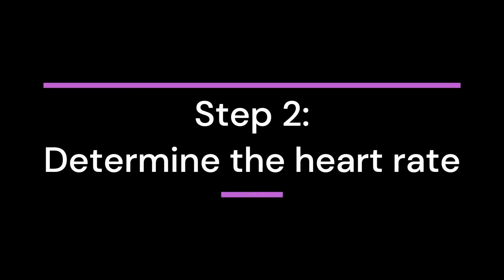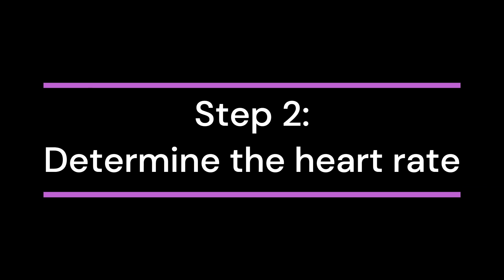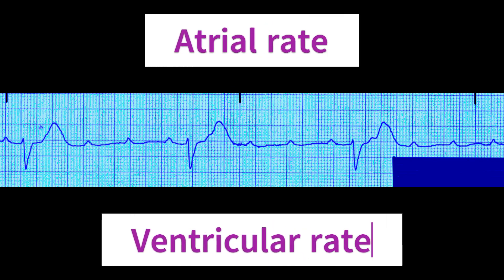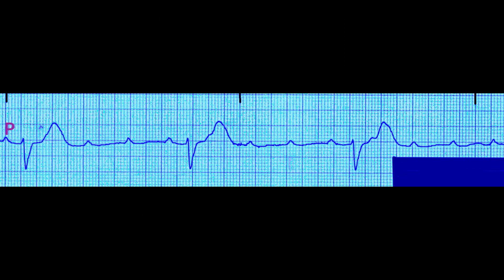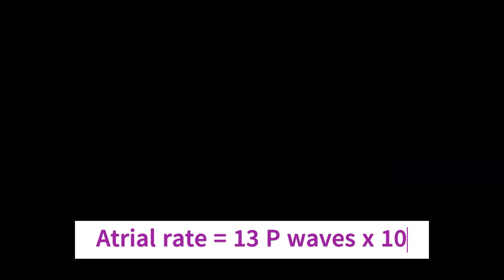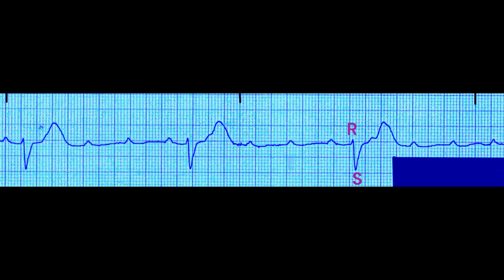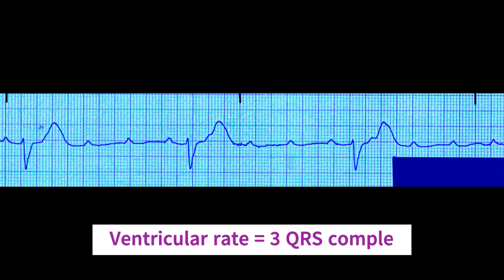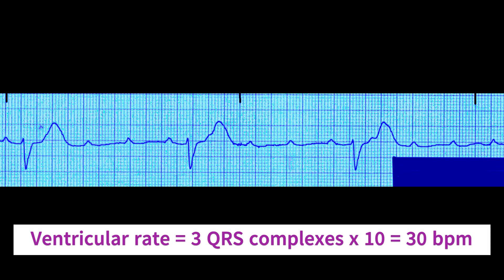Step 2: Determine the Heart Rate. There are two rates — the atrial rate and the ventricular rate. We count the number of P-waves in a 6-second section and multiply by 10 to get the atrial rate. In this example, there are 13 P-waves, giving an atrial rate of 130 beats per minute. Next, we count the number of QRS complexes, which in this example is 3, then multiply by 10 to get a ventricular rate of 30 beats per minute.